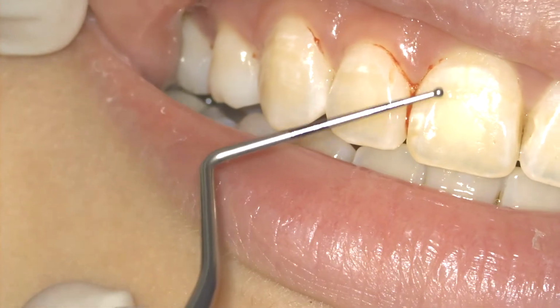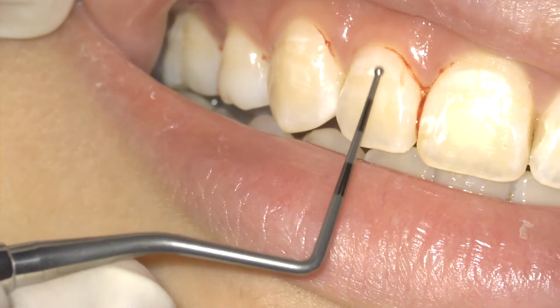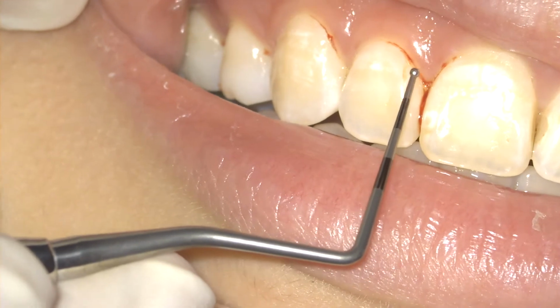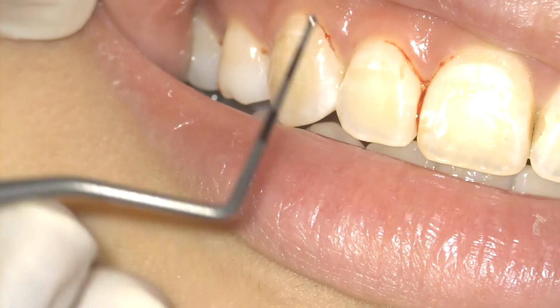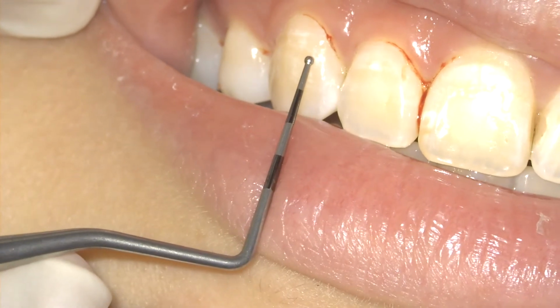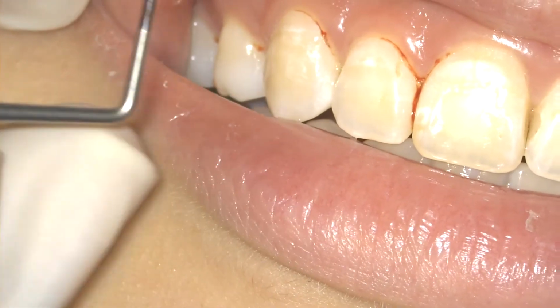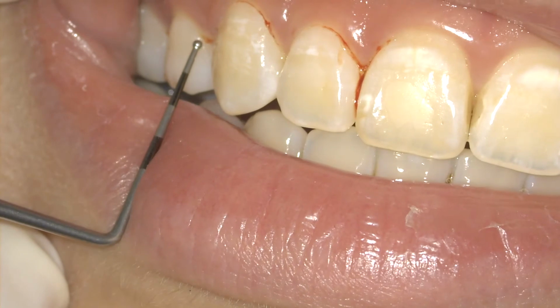Now let us try to apply the scoring to the bleeding that is seen in this case. As you see here, when we probed and took out, the bleeding point is here, and it is only restricted to the embrasure space. But it is not an isolated bleeding point, rather it could be 2 or 3 bleeding points. Hence, I can give a score of 2 in this situation. For the next unit of papilla, there is only one isolated bleeding point. There is no further bleeding anywhere. So this could be a score of 1. Even here, there is only one isolated bleeding point. Hence, the score could be 1.